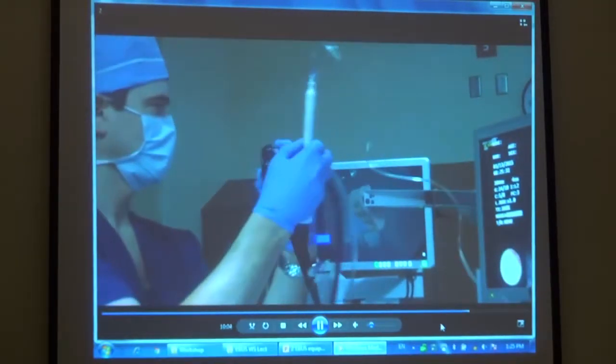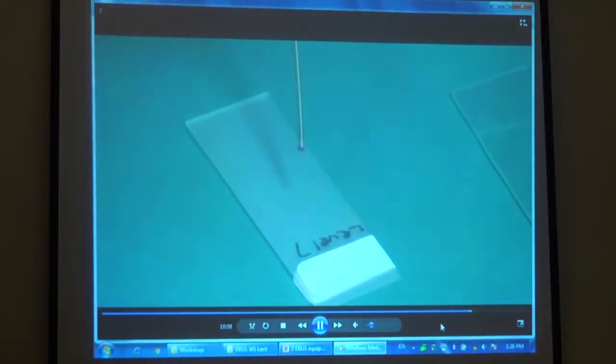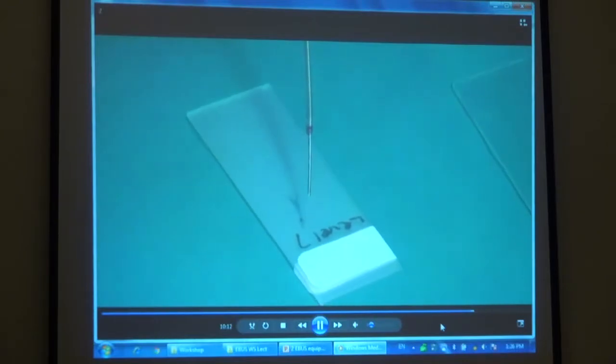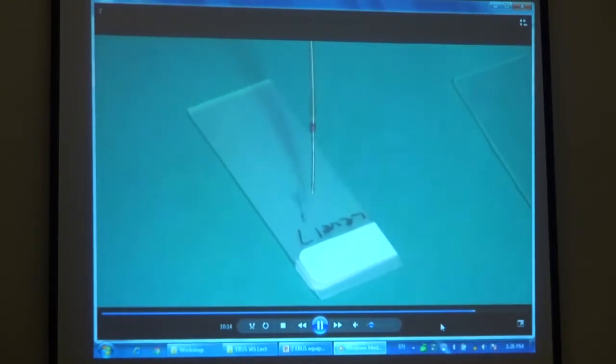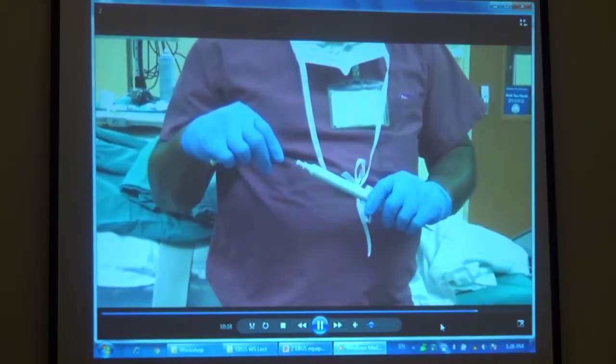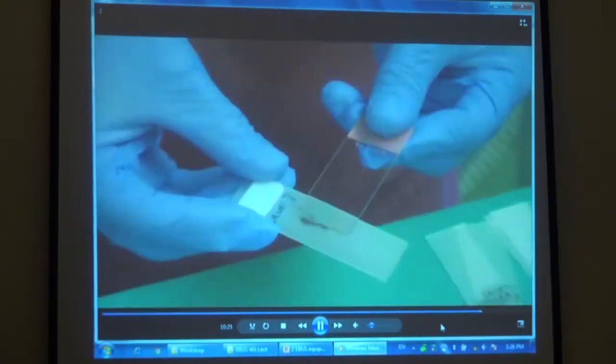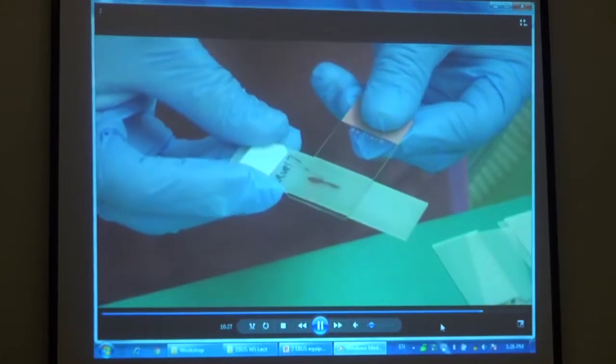This is one of the reasons why we prefer to perform these procedures under general anesthetic. Efficient specimen handling is vital. Once obtained, the specimen should be quickly handed off to the assistant who advances the needle from the sheath. The stylet is reinserted, which pushes aspirated material out of the needle. A single drop of aspirate should be placed at one end of the label slide, and another spreader slide used to smoothly create a monolayer of cells.